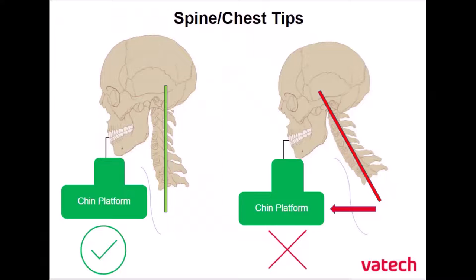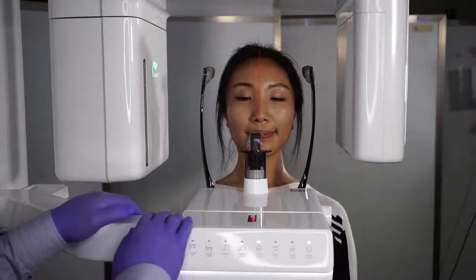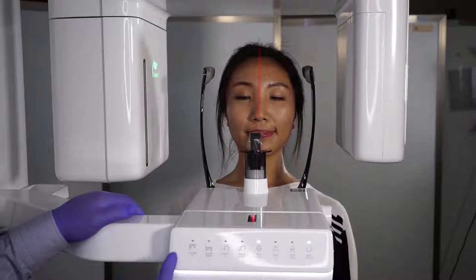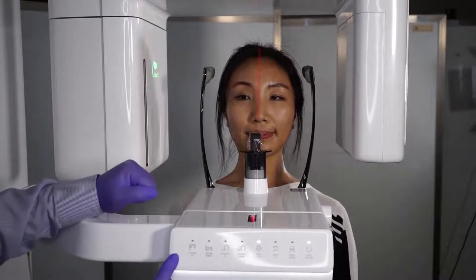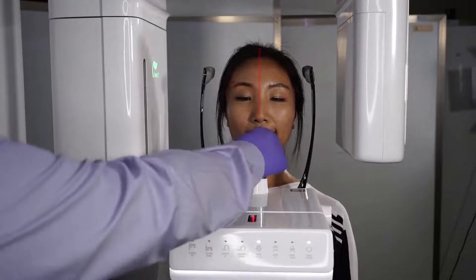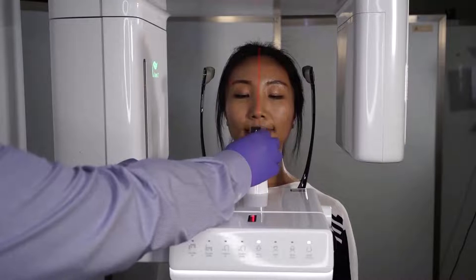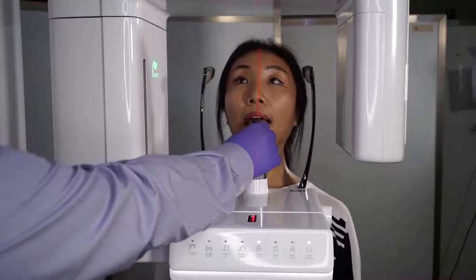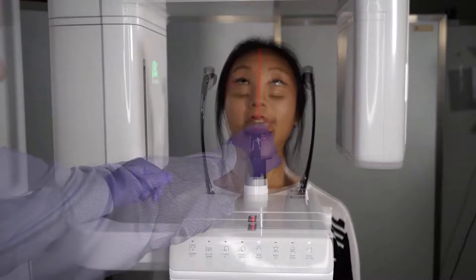Ideally we want the patient's spine as straight as possible and chest close to the device, so we'll have the patient take a step forward and notice the angle of the body. The goal is to have the spine as vertical as possible when biting on the bite stick to avoid spinal shadowing. With a clean bite stick cover, have the patient bite on the bite stick within the grooves firmly in place.